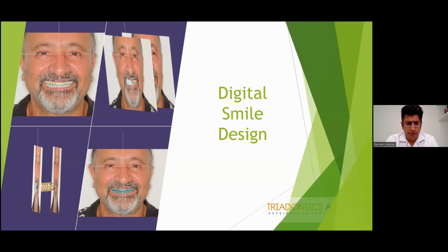5-6 years later, fast forward, this is a case which was done, I think, at the beginning of this year. You don't even have to go for a 3D DSD. We are doing it now with a digital smile design, because the matching between an intraoral scan and a facial scan is so accurate now. You can do a digital smile design even on 2D pictures.